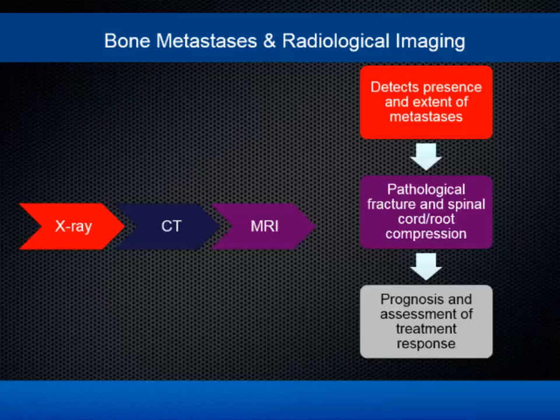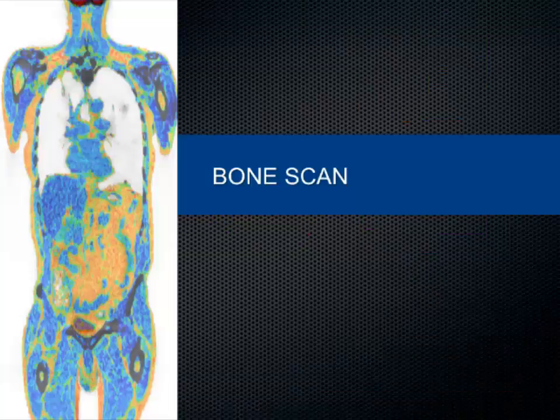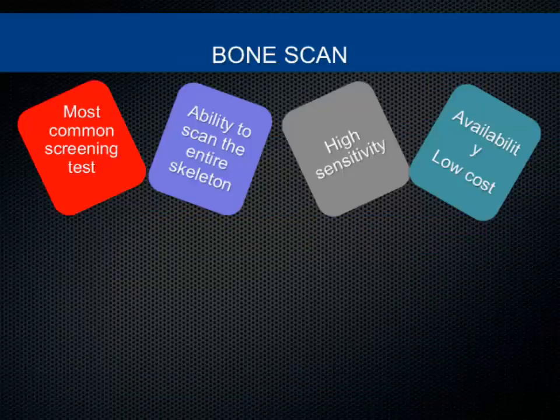And I think the PET CT will be the mainstay imaging modality. Any oncology, they will start with a PET CT for any diagnostic. So it will be known as imaging sciences rather than separating us, putting a barrier into saying that I'm a radiologist or I'm a nuclear medicine physician. Actually, the future will be called as imaging specialist with a special interest in one of the areas of cancer rather than a modality. Coming to bone scan, that's the mainstay of nuclear medicine. It's a main common screening test also, and it's got an ability to scan the entire skeletal system.